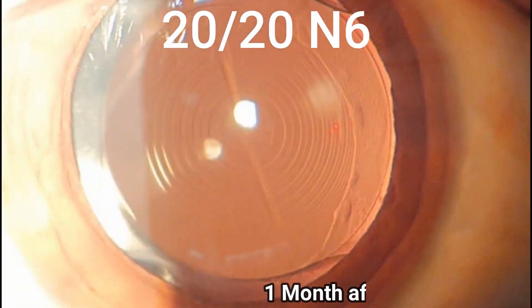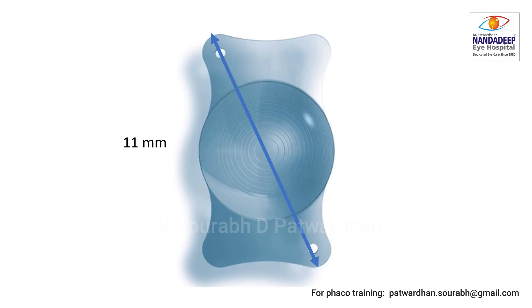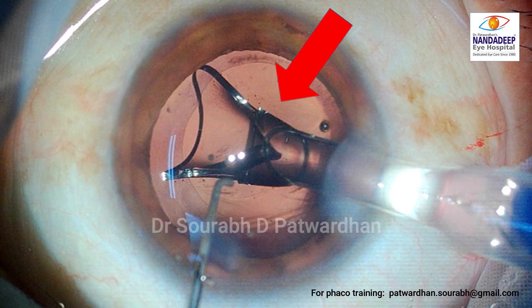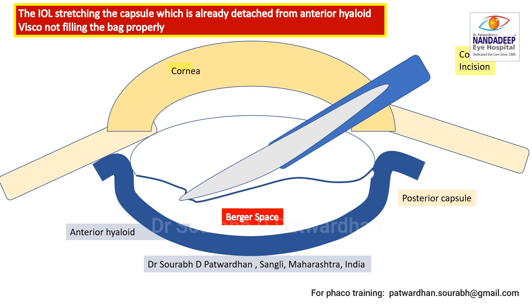How would you tackle this particular case differently? And why did this happen? The IOL design is a plate haptic design with 11 millimeter diameter. Probably in this case the injector cartridge was deep inside the bag — you can see the cartridge is at the center and quite deep. It is also probable that there might have been less viscoelastic inside the bag and the anterior vitreous might have already separated, leaving the capsule a little bit redundant. So as the IOL progressed, it stretched this capsule and caused a PC tear in the center. This was the most probable cause in this particular case.